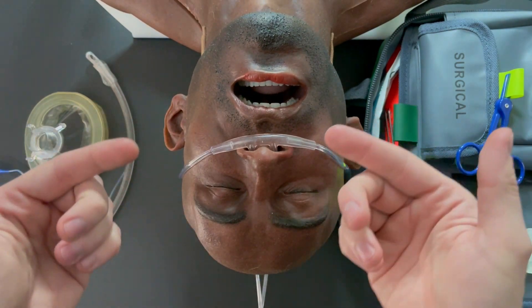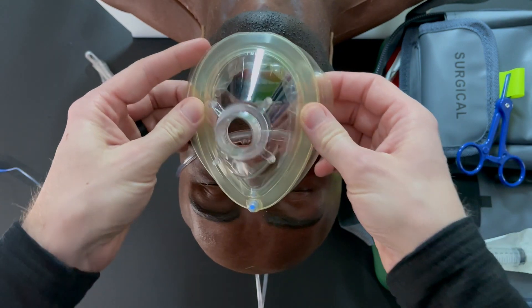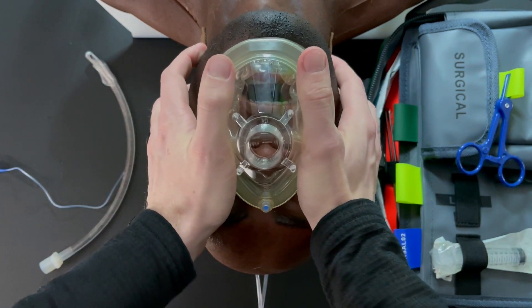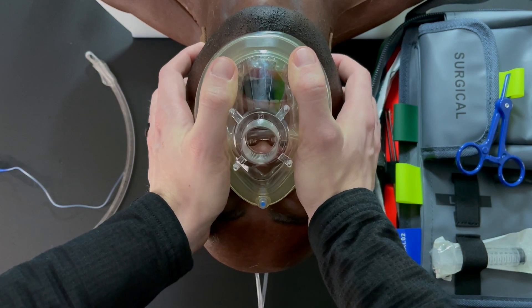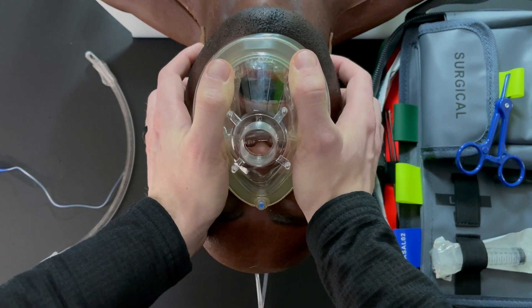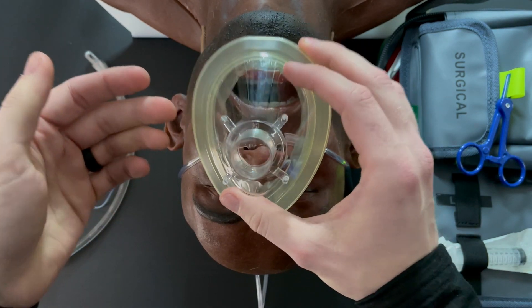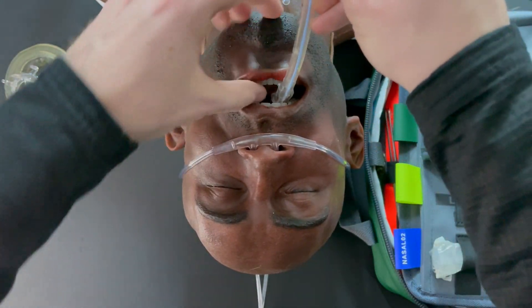The reason for routing it this way is that you keep the nasal oxygen on during the apneic period and during your intubation attempt. So you'd set it up like this, and keep that nasal oxygen in place while you intubate the patient.